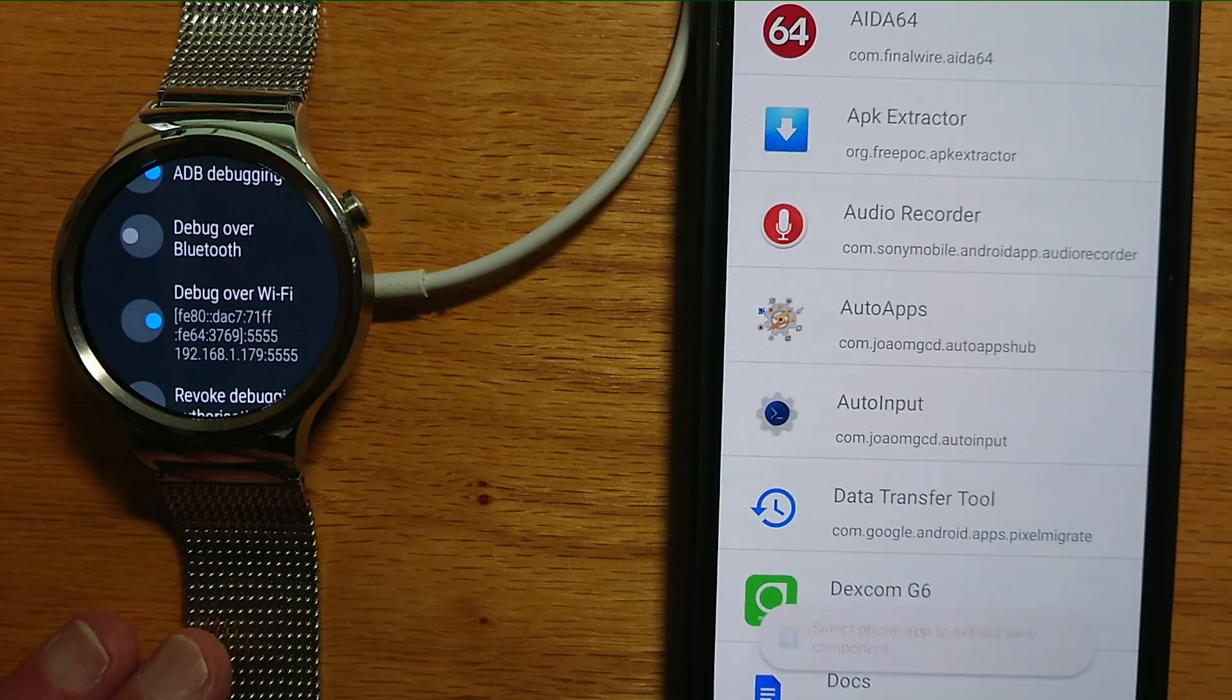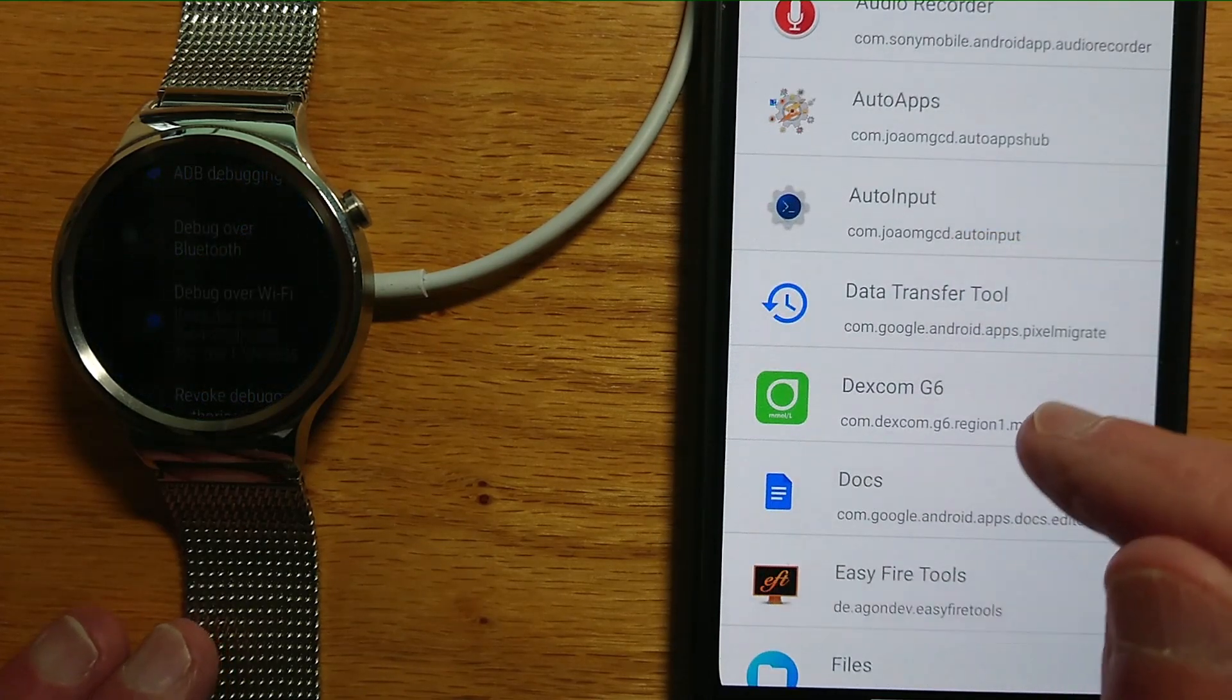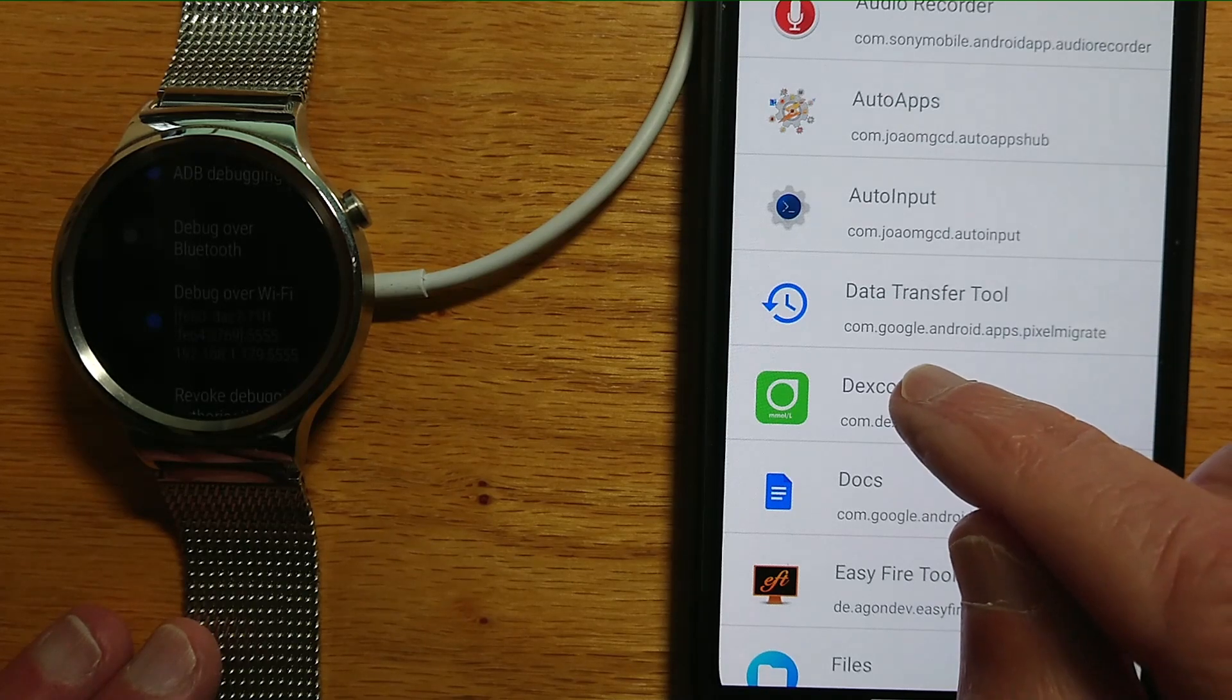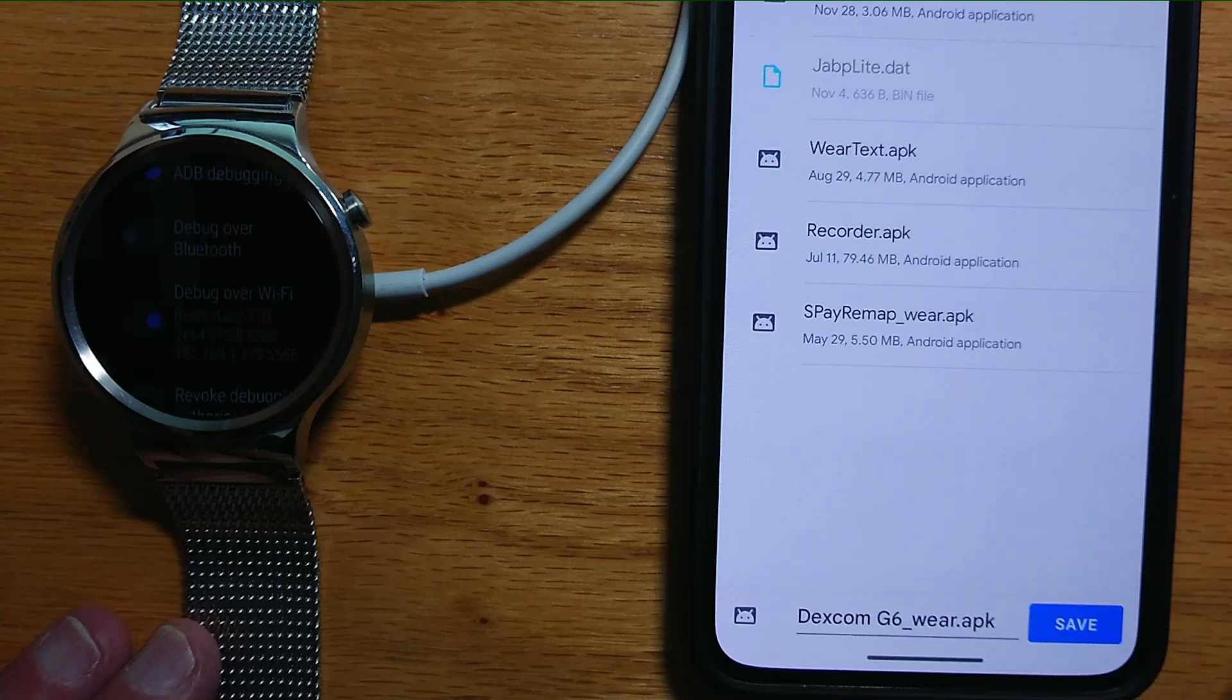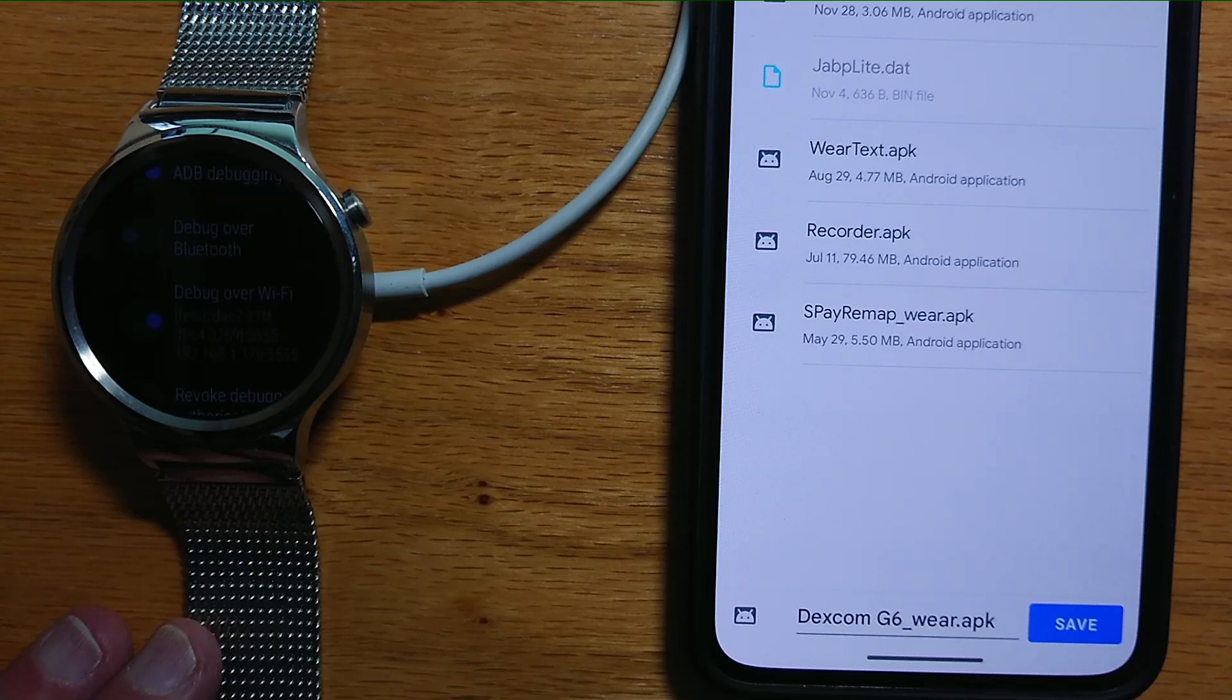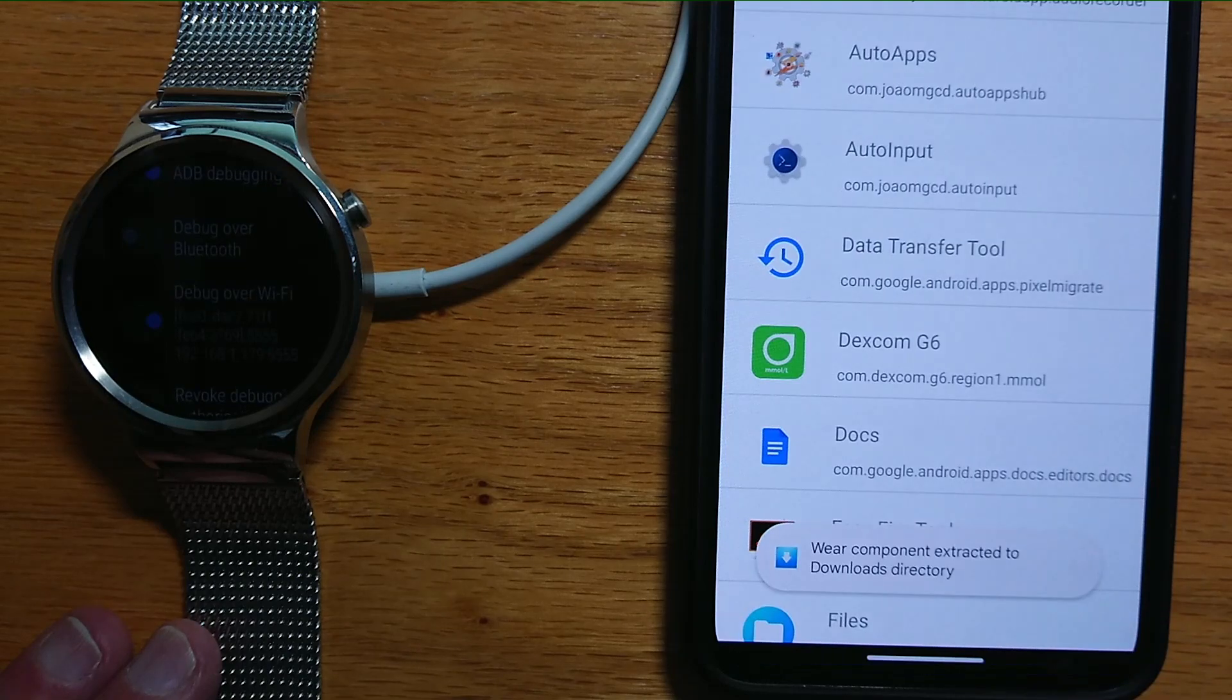Let's restart, and this time let's long tap Dexcom G6. It offers me the option to save the Wear OS APK into the downloads folder on my phone, and let's say Save.